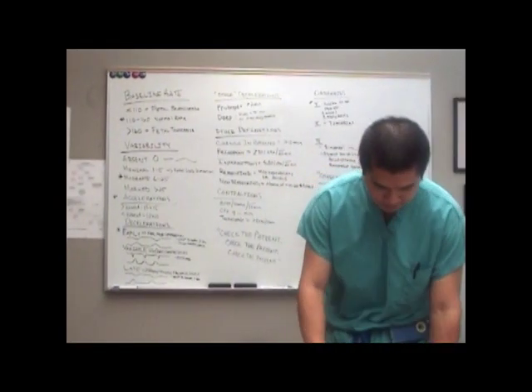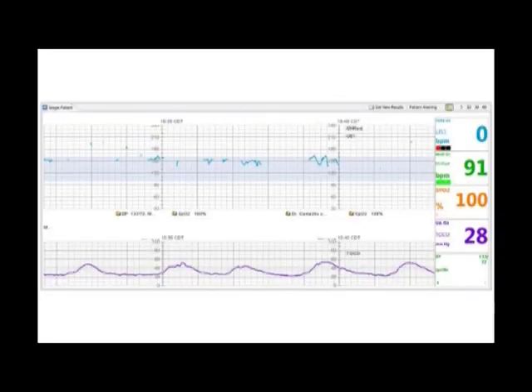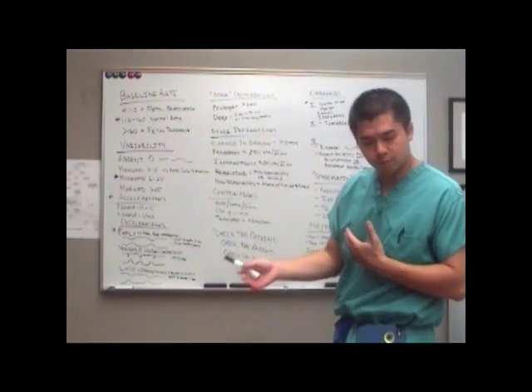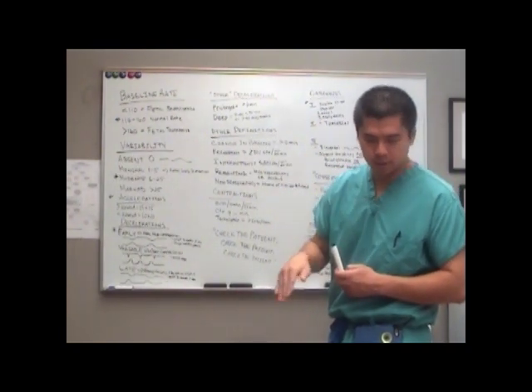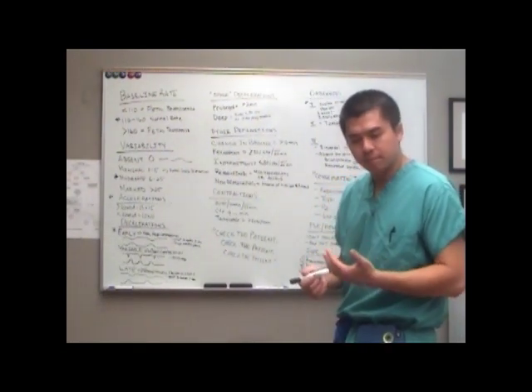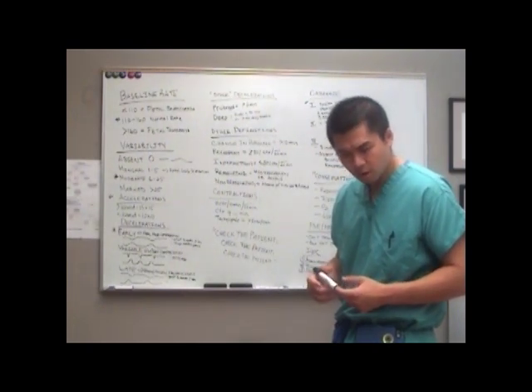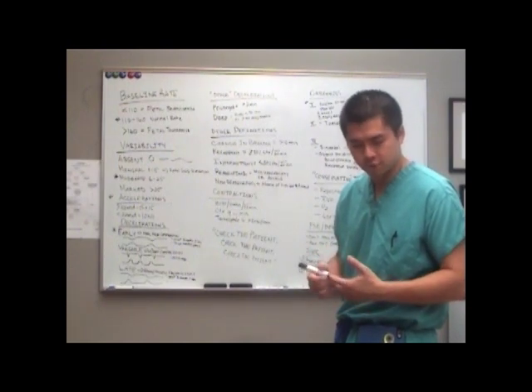Let's look at a few examples. In this first example, you can't really trace the baby at all. There's contractions. I don't even have enough fetal heart tracing to determine whether or not it's really reassuring even in between. And sometimes you'll look at a fetal heart trace and things will pop off, and typically heart traces don't drop 90 degrees. So if you see something that's low that you think may not be the baby's, what's something that you can put on the patient or have the nurse do?